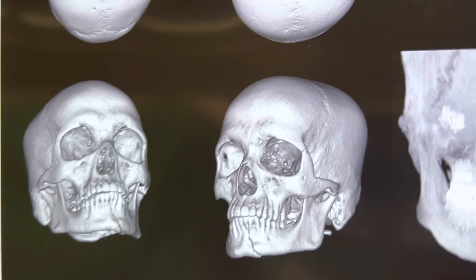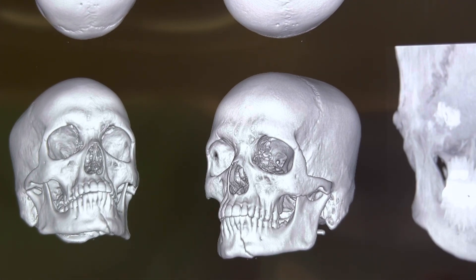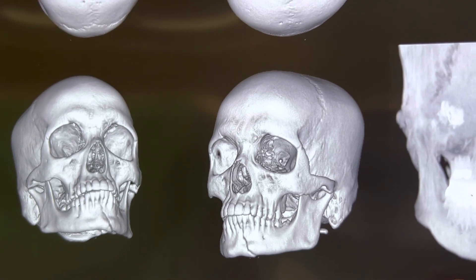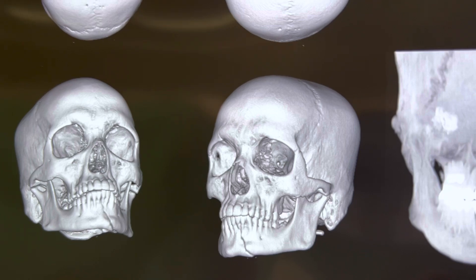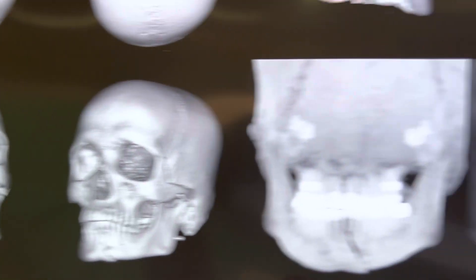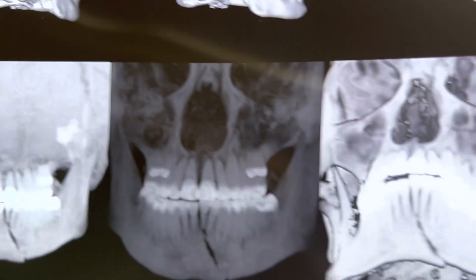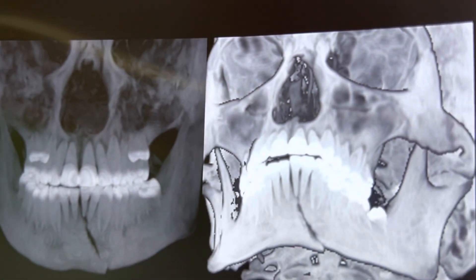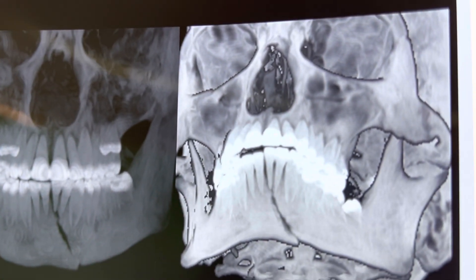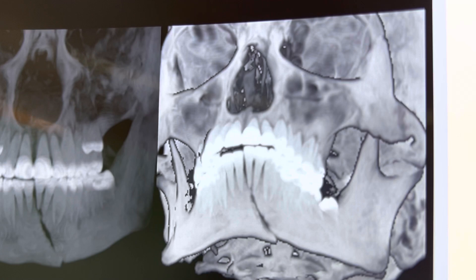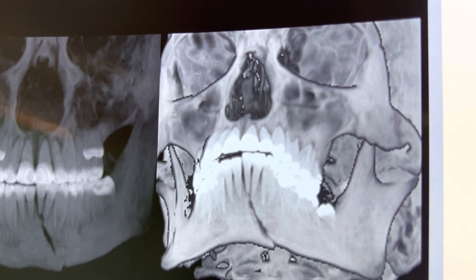This is the CT scan of this patient who was just in a road traffic accident. You can see the fracture in the symphyseal region very clearly — it's a minimally displaced one.